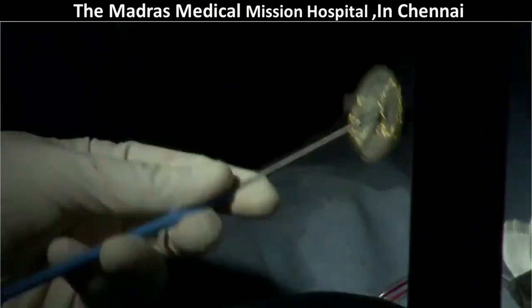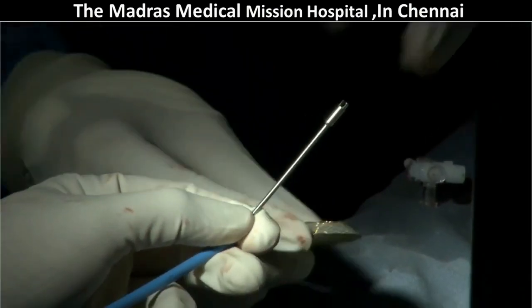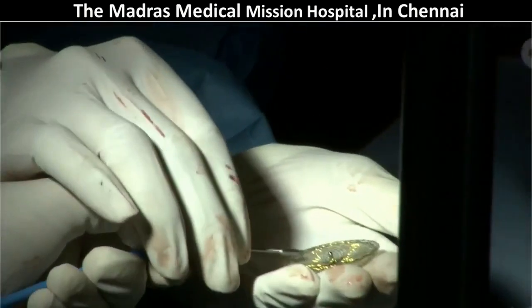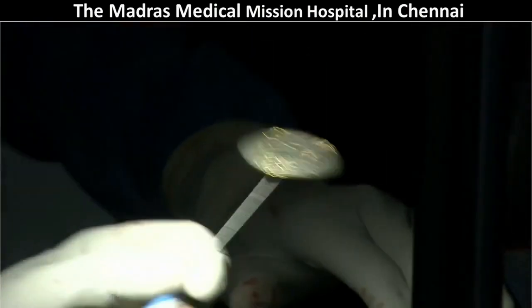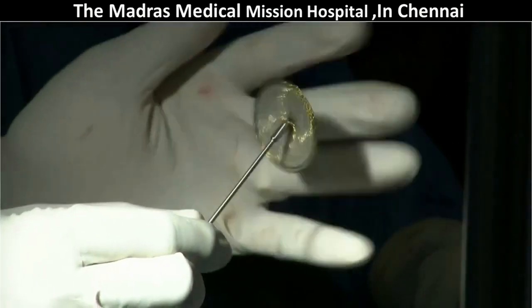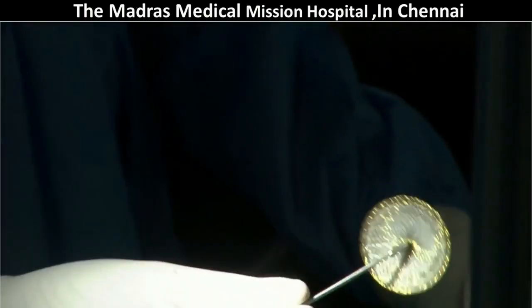The type of deployment is also different. It is actually something like a bioptome-like device. So you can see that the bioptome is now opened, and we catch the hub of the device with the bioptome. And so the device actually is flexible in the angle between the cable and the device.